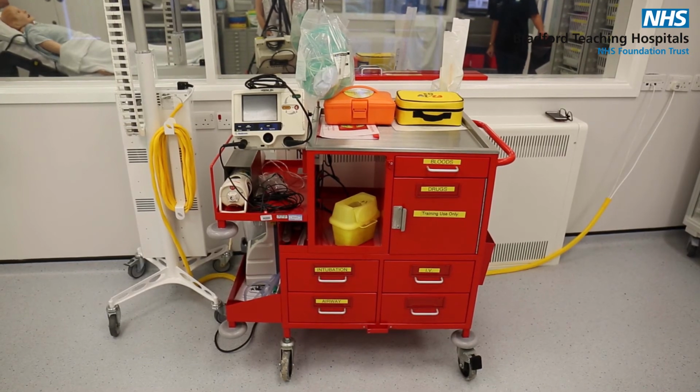There is a crash trolley available to use, and this is laid out in the same way as they are in clinical practice. Please be aware, however, that this is a live defib and not a training one. So bear this in mind if, as part of your scenario, you are required to deliver a shock to your patient. All the mannequins that we are using are able to receive a shock.